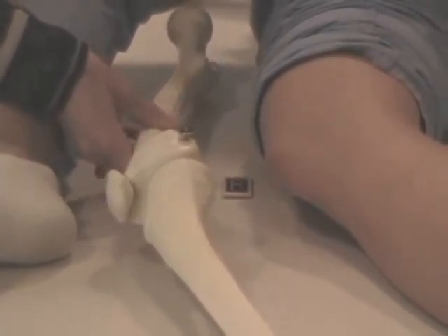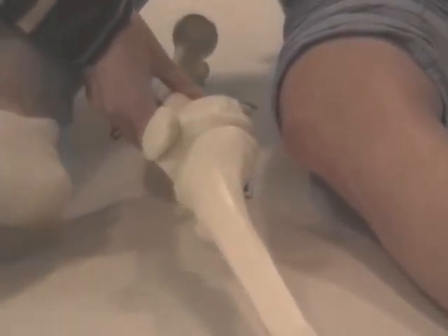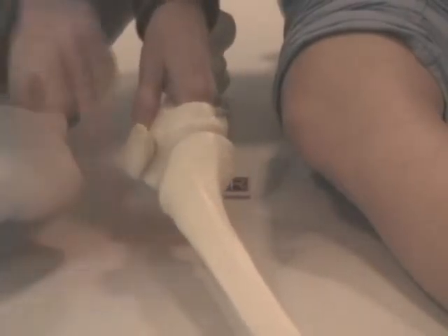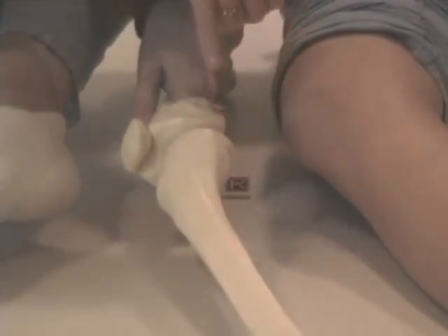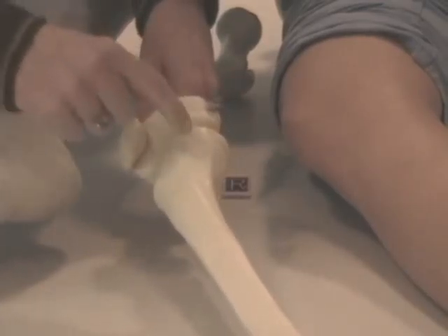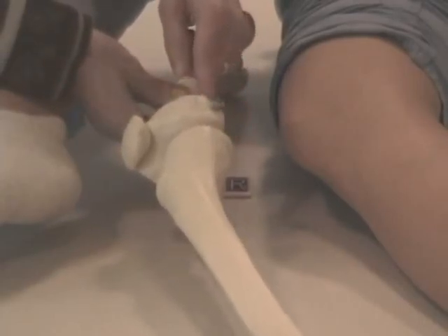And on the opposite side, if the knee is too far away from the table, like that, look what's happening to the space between the fib and the tib. The actual space is closed. Most of the fibular head is right underneath the tibia. And what will happen to the adductor tubercle?